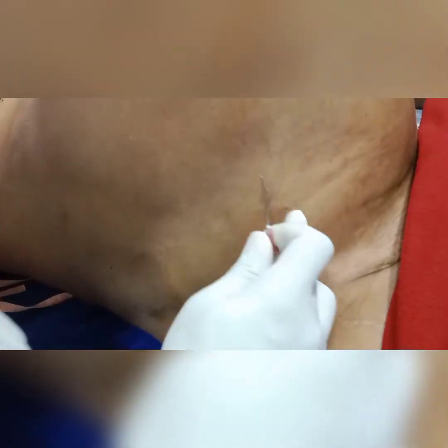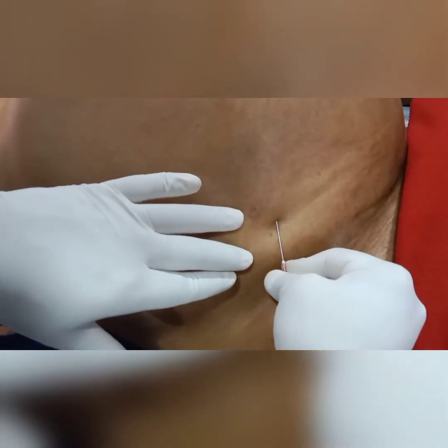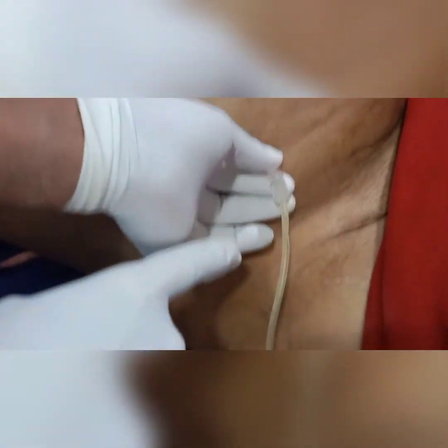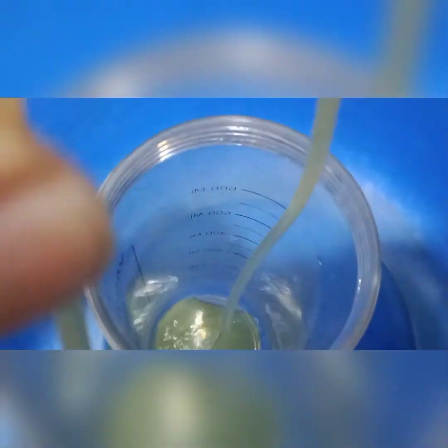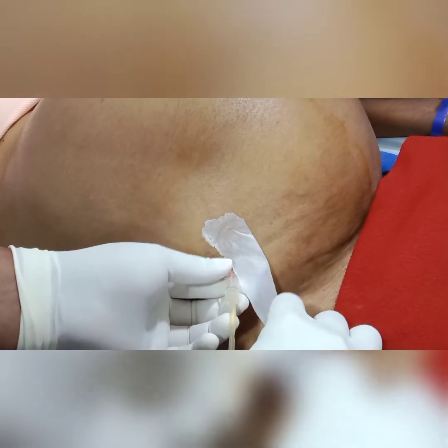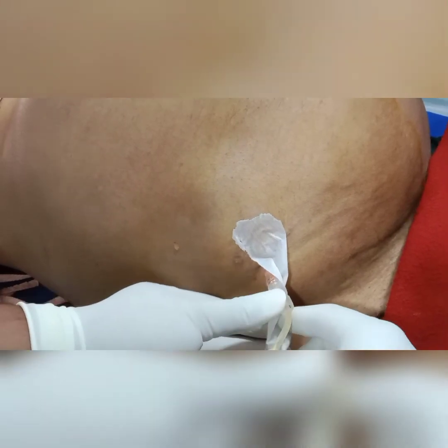Gauge needle for the purpose of drainage. So here you can see straw colored semi-transparent ascitic fluid coming out. The needle can be fixed by a simple technique using micropore or dynaplast.